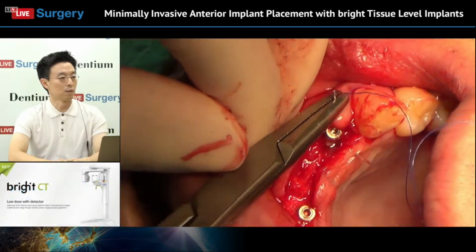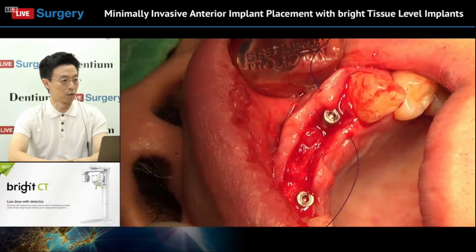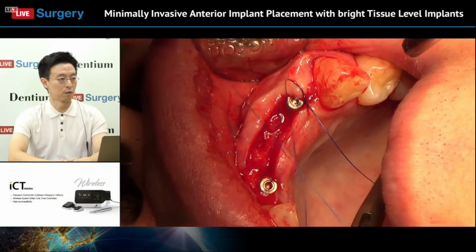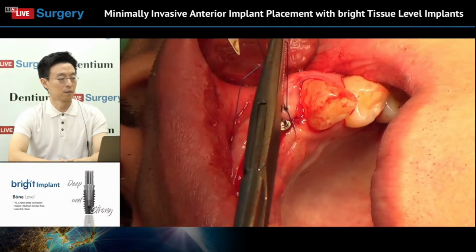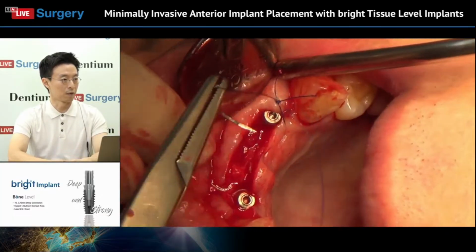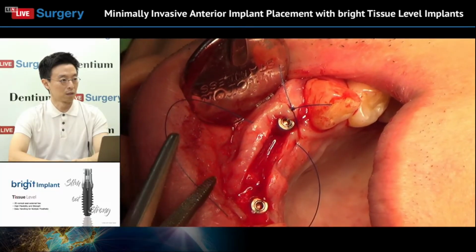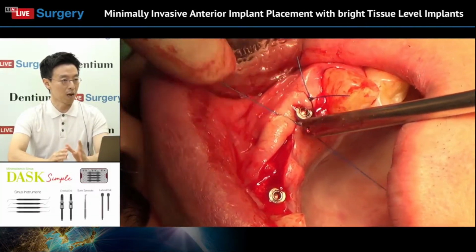Implant fixture placement and bone grafting were done. So I'm doing the suture around the surgical site. I always start the suture in the key point area. In this case, the grafted bone site is the key point area.